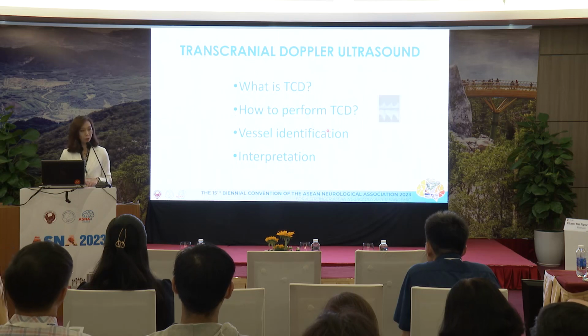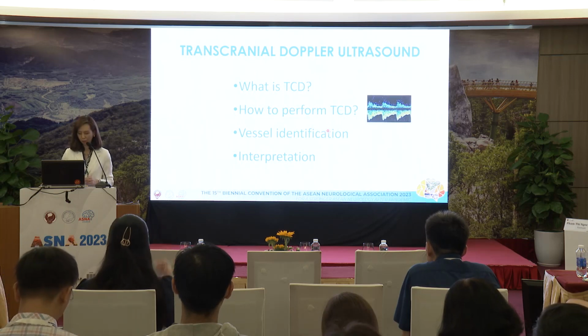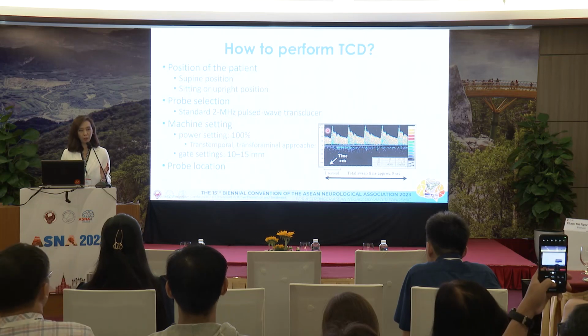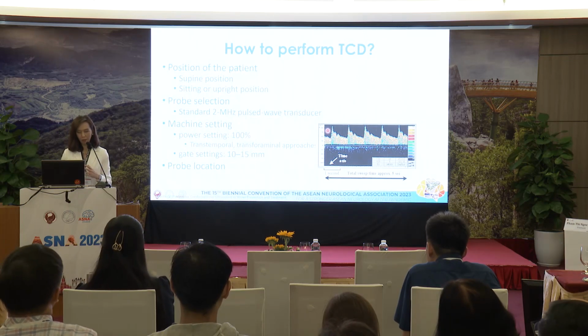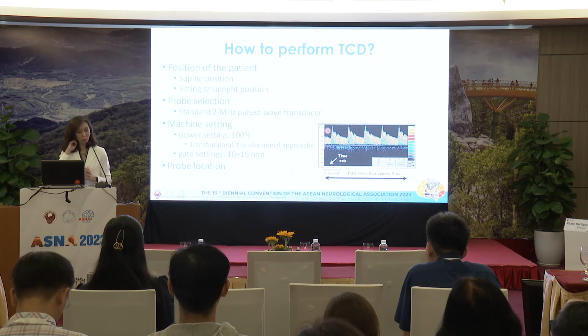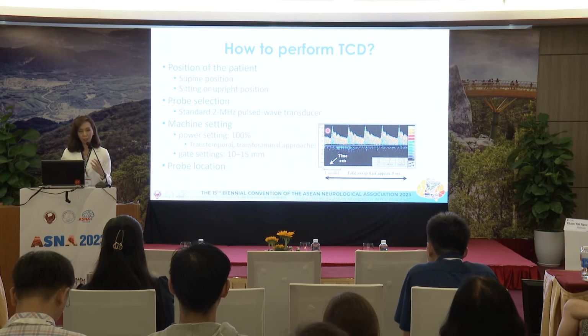So how to perform TCD examination? It's actually the same as Dr. Ramani mentioned earlier. So you start off with positioning the patient. Usually, patient can lie down in bed, and we are at the head area of the patient, or in some windows, like for example the occipital or transforaminal window, patient needs to lie on the side, or sometimes we sit the patient up and let them bend their head as much as possible. So we open up the foramen magnum to insonate the vertebral and basilar artery.